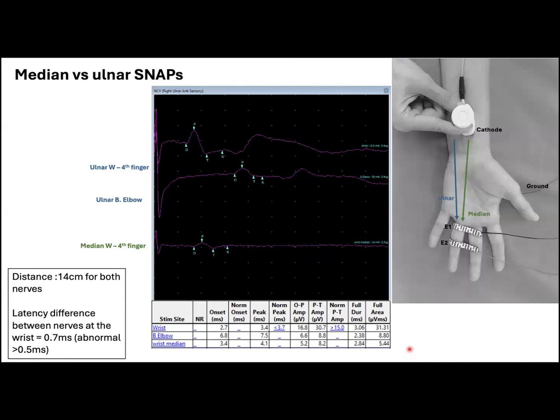Here we have another example of antidromic snaps with motor artifacts that can happen even with low-intensity stimulations. This recording is from the ring finger, while stimulating both the ulnar nerve at the wrist and elbow and the median nerve at the wrist in the same patient.